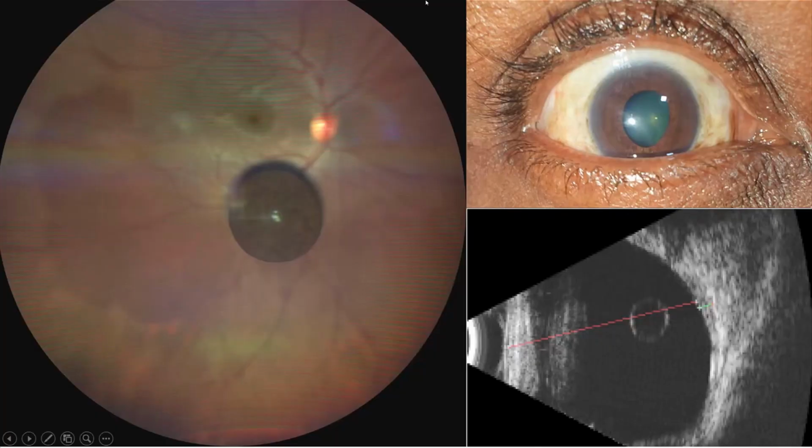So this is a very interesting case. Here is a 40-year-old male who came to our department with complaints of near vision deficit. But on examination, we found a brownish cyst floating in the vitreous cavity. So remember, it's a phakic patient. But the clue is in the B scan. So can anyone just guess what this is?